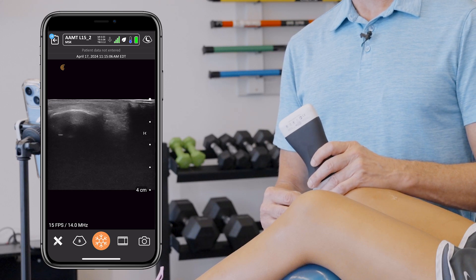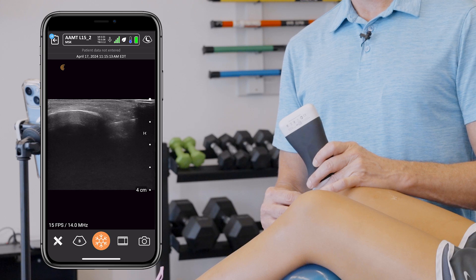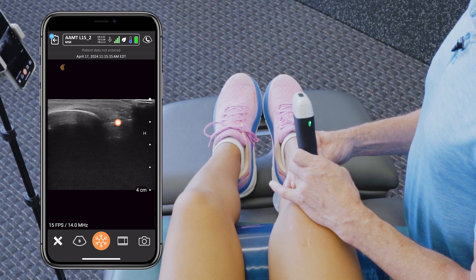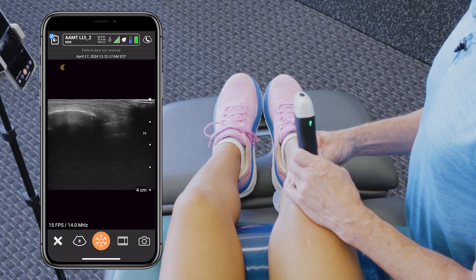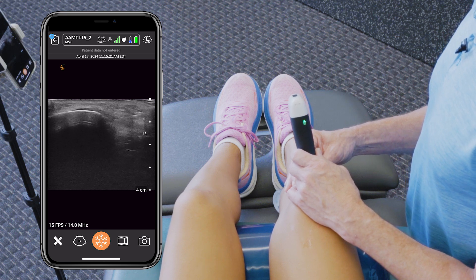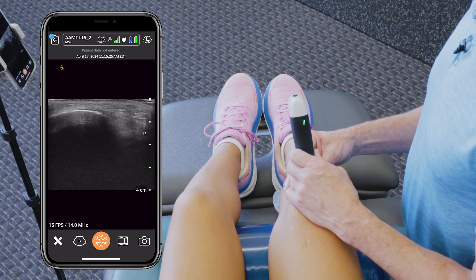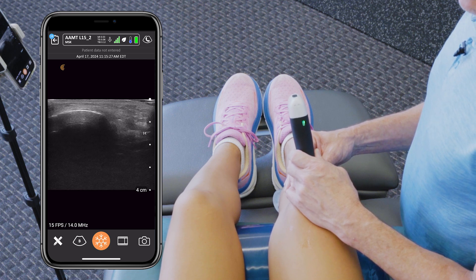We're going to come in again distal to proximal, take the needle, and place it in there. Once we make contact with the inferior pole of the patella, we're going to do some periosteal pecking to create a greater healing response for a chronic tendinosis, for example.